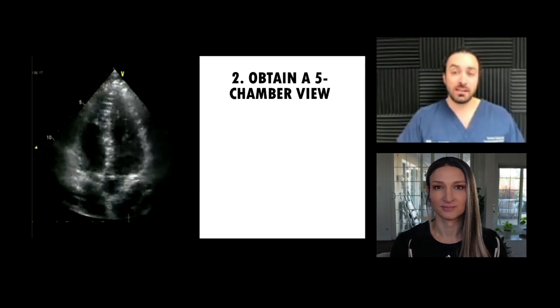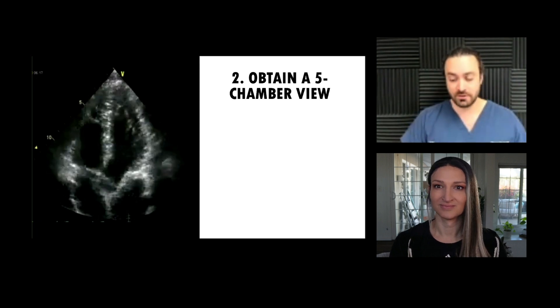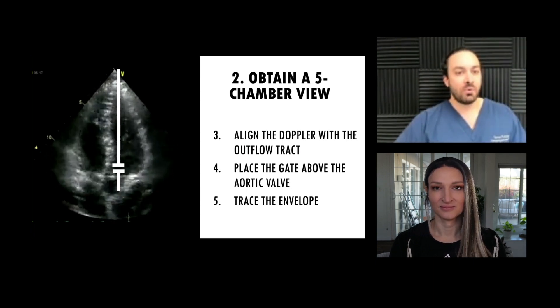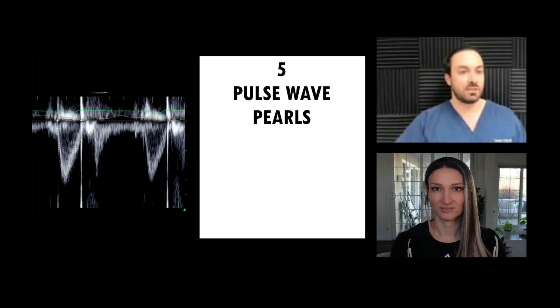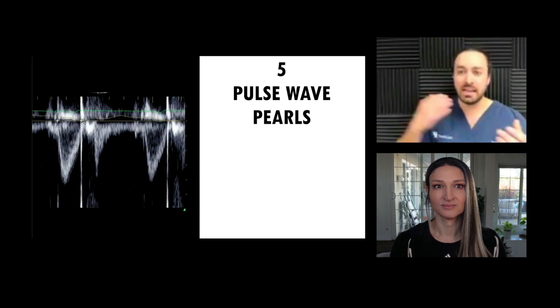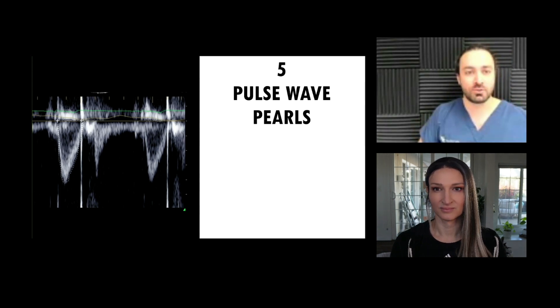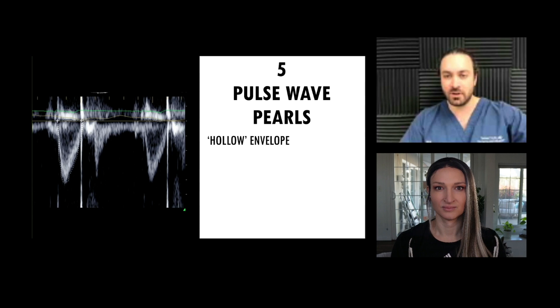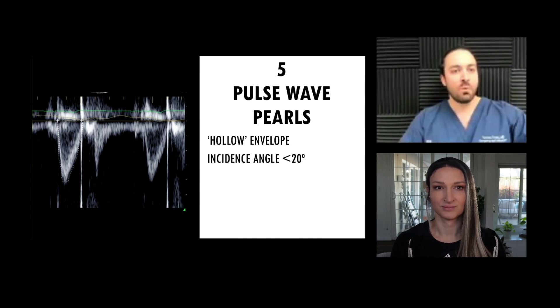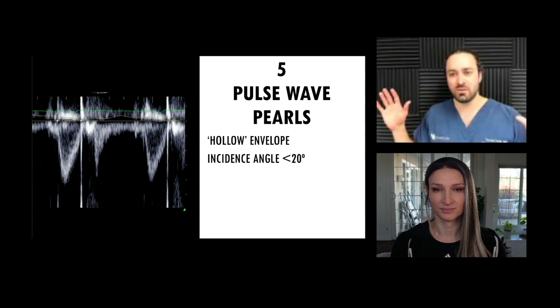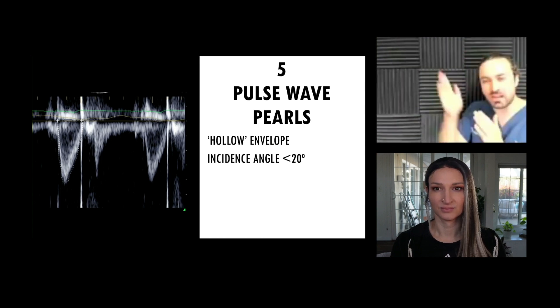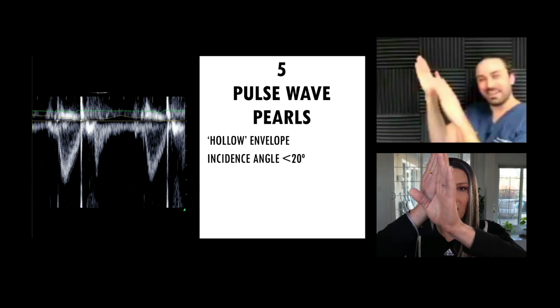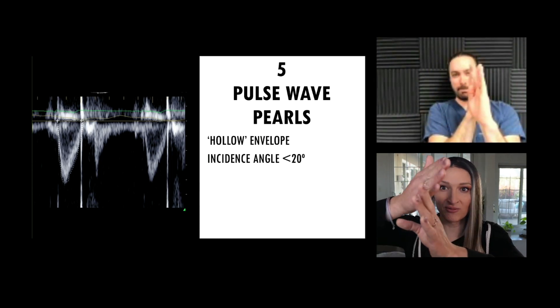Then we're going to get our five-chamber view — the four-chamber view is good, but truthfully it's the five-chamber that's the best. We're going to align our Doppler with the outflow track, right proximal to the valve, and hit that pulse wave Doppler button and trace the envelope. We get this signal — you'll need a little familiarity with how to get a good pulse wave signal. What we see is a nice hollow envelope: a crisp outline with less signal in the middle. We want our angle of incidence less than 20 degrees — this is true for all things in echocardiography. If the blood is flowing this way, we want to measure it the same way, meaning no more than a 20-degree difference between flow and your Doppler angle.